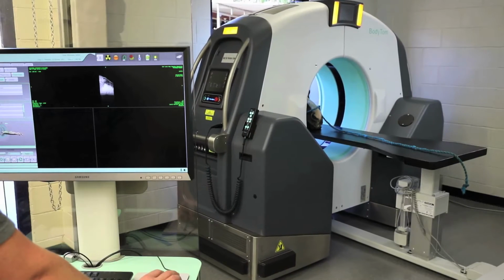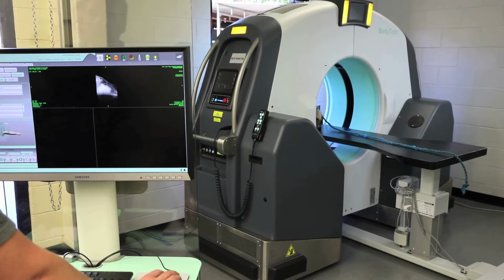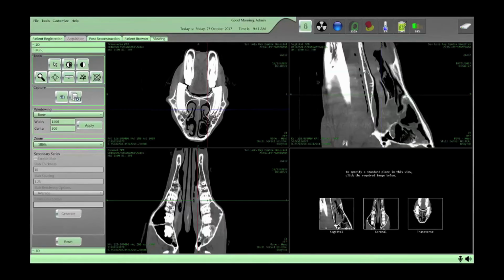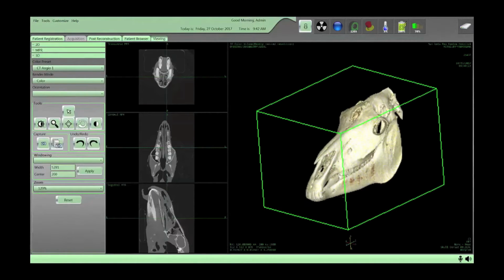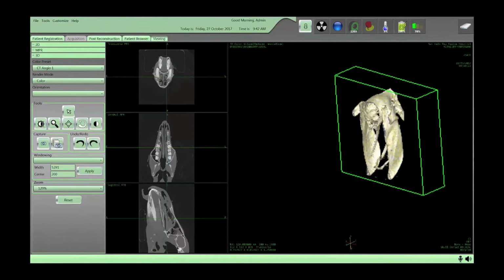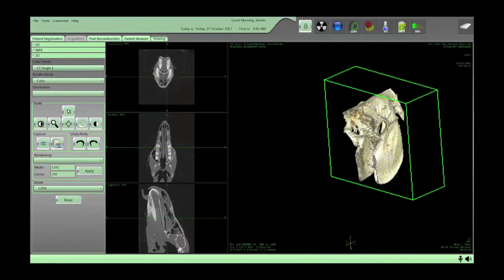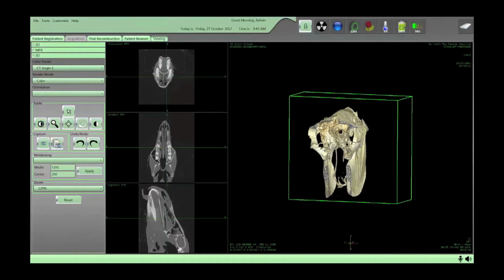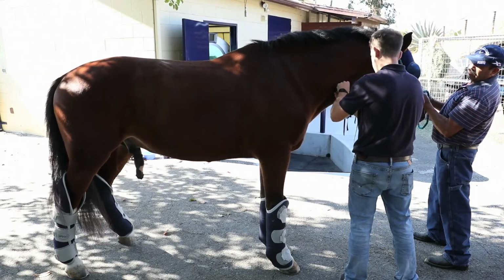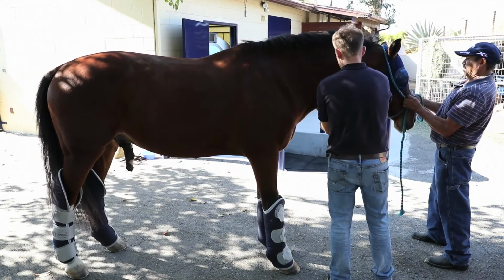In addition, we've had some very unique cases where we have either internal ear disease without stylohyoid disease, or in combination and unilateral or bilateral. The ability to see that, or with head trauma, we're able to image those cases. We've also successfully imaged a lot of head trauma cases with basal sphenoid fractures, and we've successfully done those under standing sedation. So even if we have a patient that has suffered head trauma, the majority of them can be imaged under standing sedation without the need for general anesthesia.